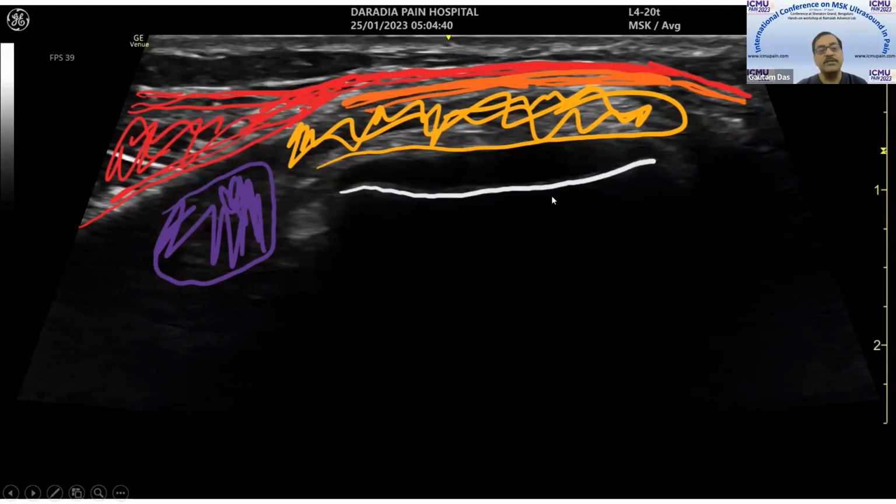Here, one very important thing is that this is your quadriceps tendon. If you are holding it from the medial to the lateral, I'll be showing you how we are holding the probe here. The probe position picture is not there. But what is important here, the synovial sac bulges both above and below the patella, and it comes here into this space below the patellar retinaculum and the patellofemoral ligament. And this is one of the very important areas where the synovial sac bulges out just below these 2 ligaments. It is very easy to puncture there, and you can aspirate or give an intraarticular injection. I'll be showing you a small video there.